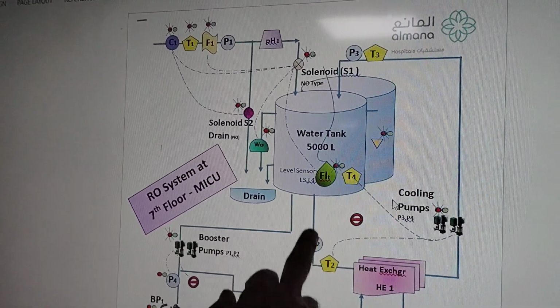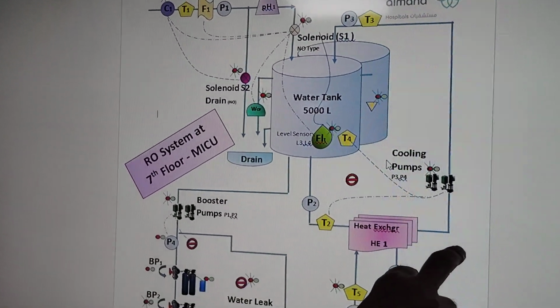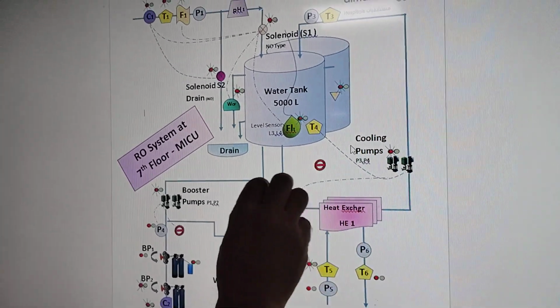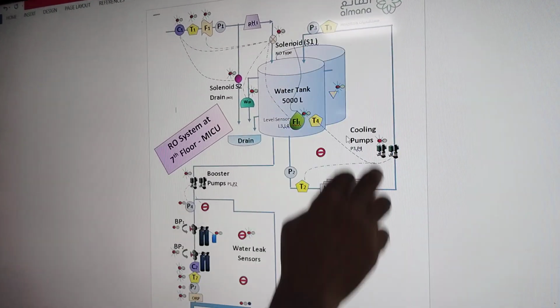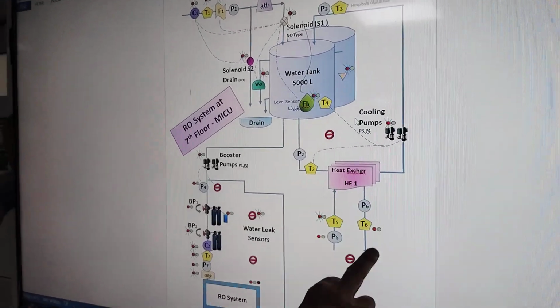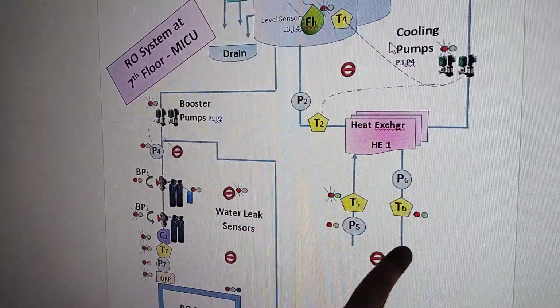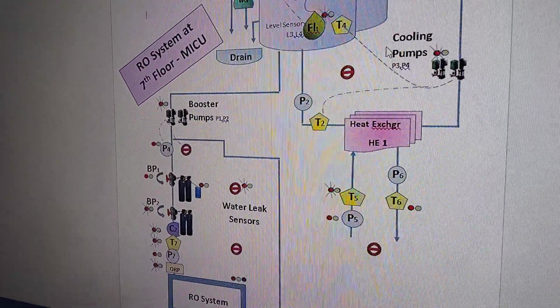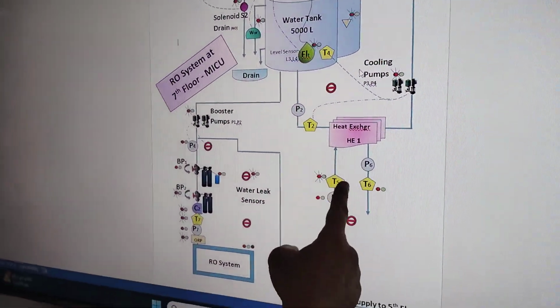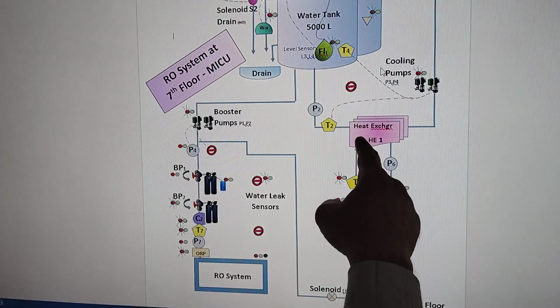Then the water passes through the cooling system. Here we have a heat exchanger, cooling pumps, and pressure sensors and temperature sensors in our water line as well as in the chiller line. This water comes from the chiller. The temperature and the pressure will also be monitored over here. If the temperature goes beyond the limit, then it will give an alarm.